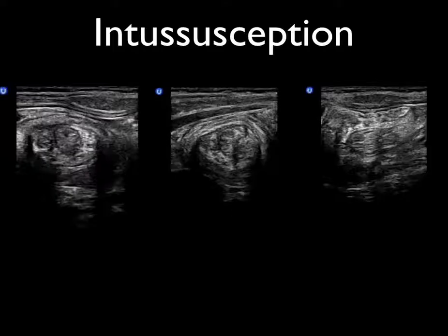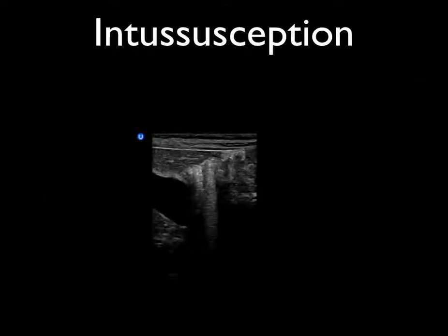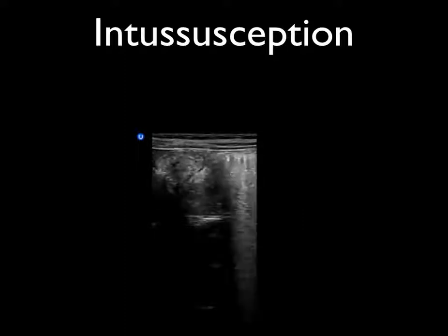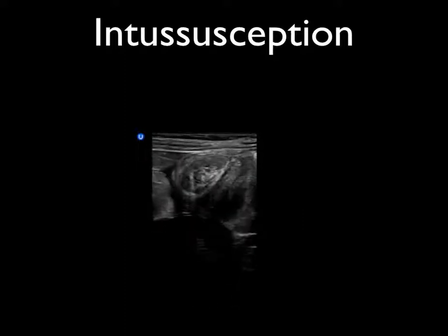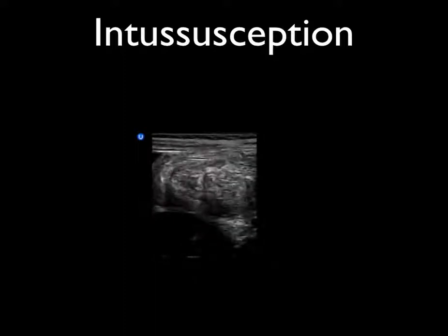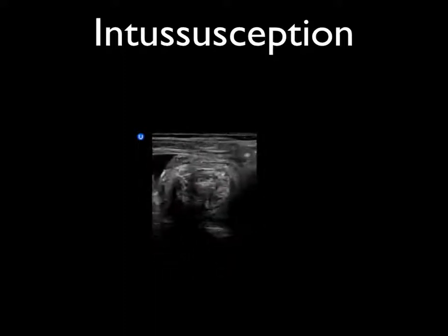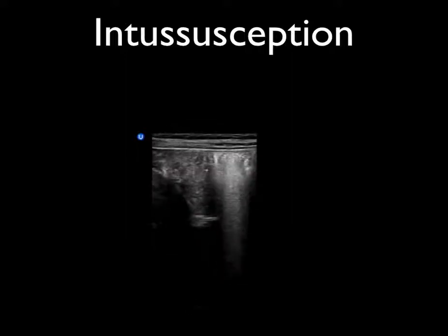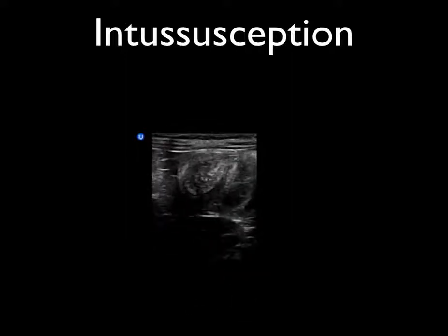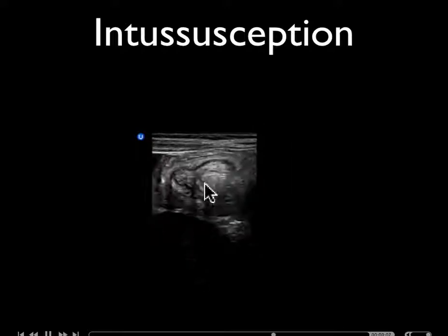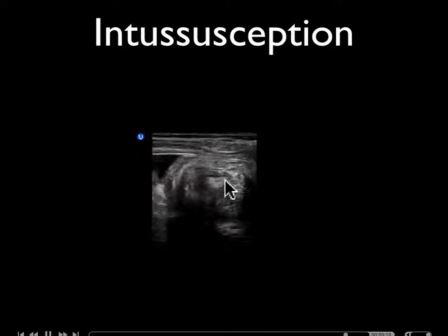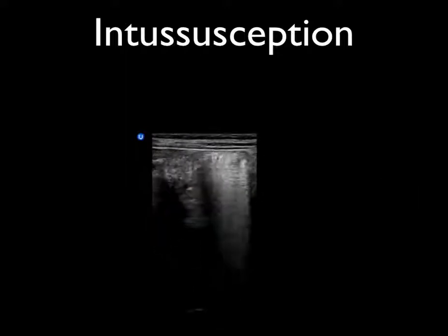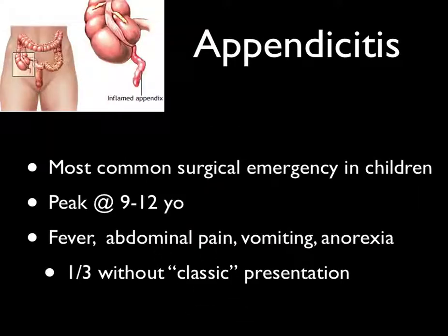Here's another straightforward case of intussusception. We see layers of bowel along with the hyperechoic segment around the inner layer. This is the actual video of this patient — we're around the epigastric area under the liver, moving to the right upper quadrant where the ascending and transverse colon come together. We can see the intussusception starting to appear right there — here's the long axis of it, and now we're in short axis at the end of it.